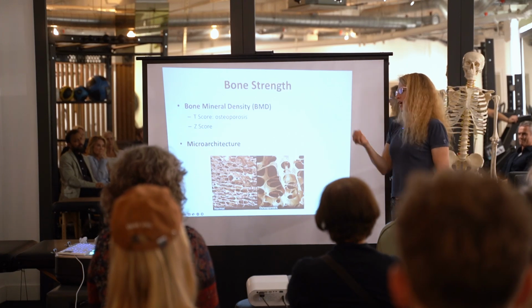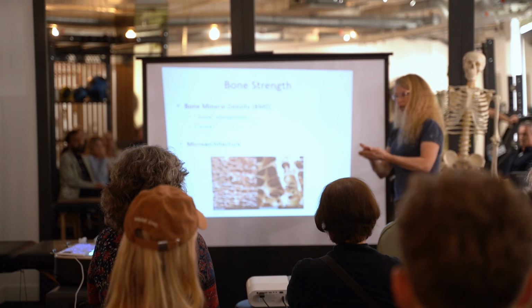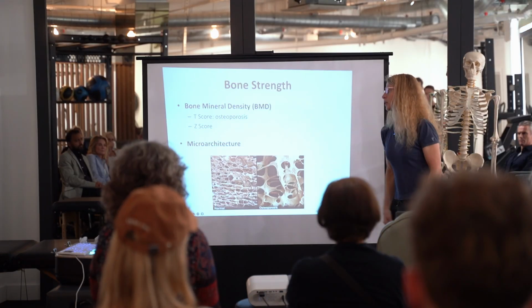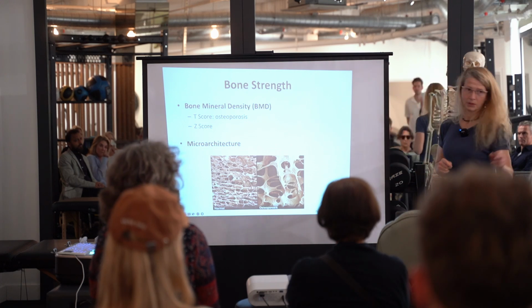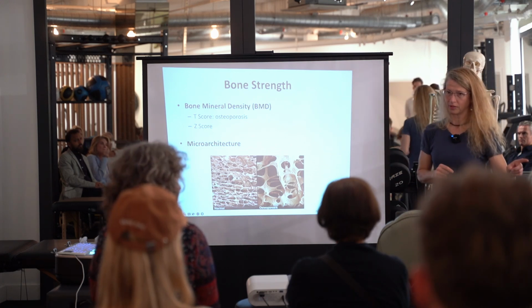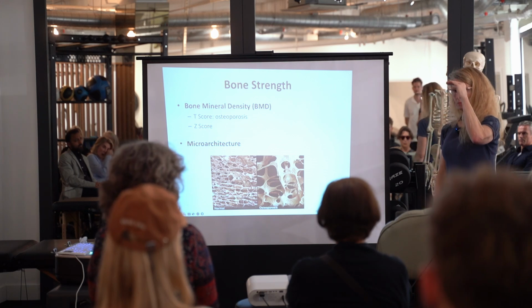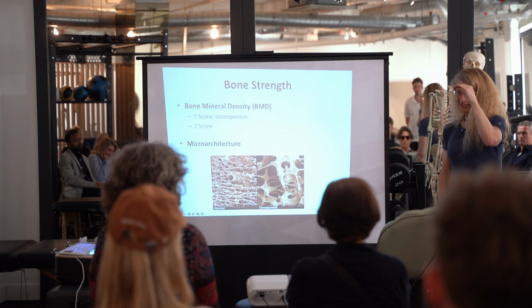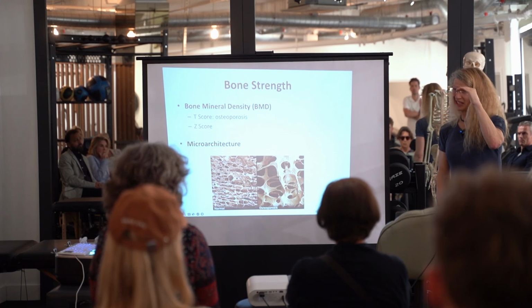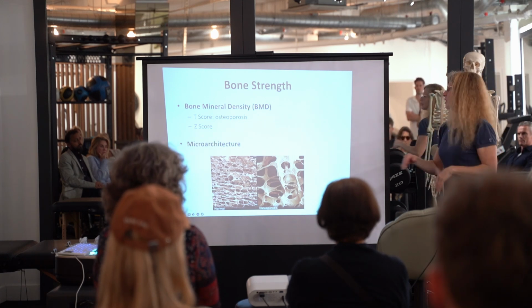But when you get this result from a scan, whether it's a DEXA or the REMS, you're going to have a report. You get two metrics. You'll get what's called a T-score, and that's comparing your measurement to the peak bone mass that Matt mentioned, okay? So what is your level compared to what we think the peak is from lots of population? Now, unless you are super fit, healthy, and 26, your T-score is probably going to be negative, to be honest with you. It's going to be below that level, of course.